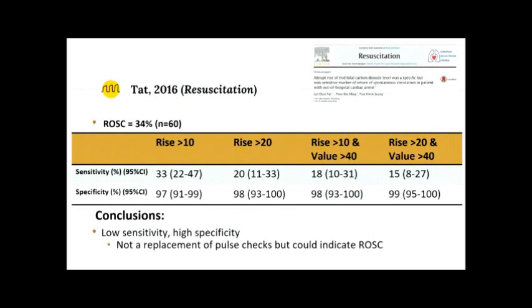And as the Europeans will say, and many of us have talked about the use of epinephrine, if you see this marker, I'm not telling you to stop your CPR and do a pulse check immediately, but it may give you the thought of not administering epinephrine to a patient in whom you have likely achieved ROSC, until you wait till your pulse check.